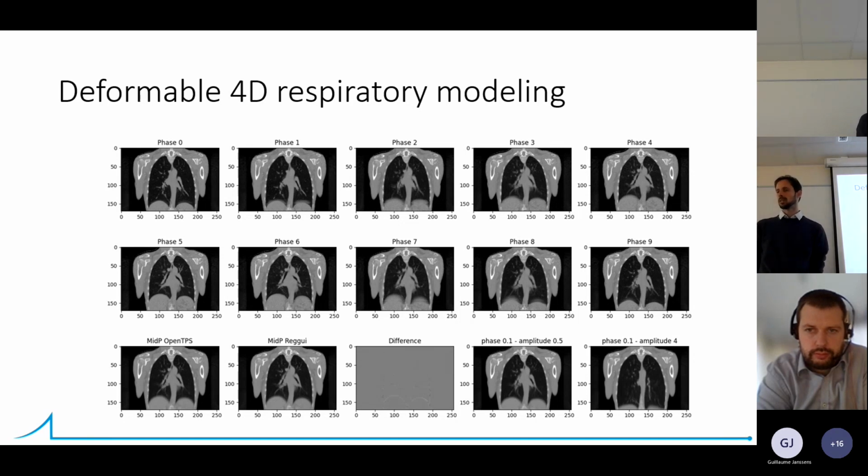Yes, that would be nice to have this wish list so that we understand a bit what are the needs that are still not met. Obviously, we cannot commit on implementing all the wish list, but it would be interesting indeed to have a wish list somewhere where we understand what are the main needs.